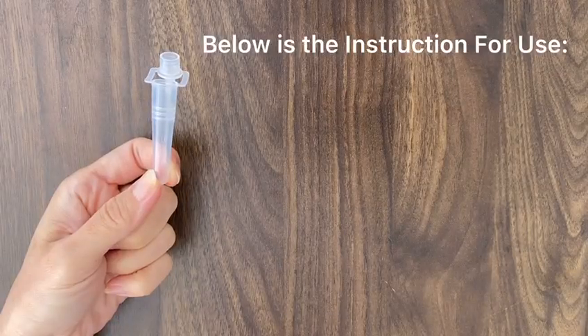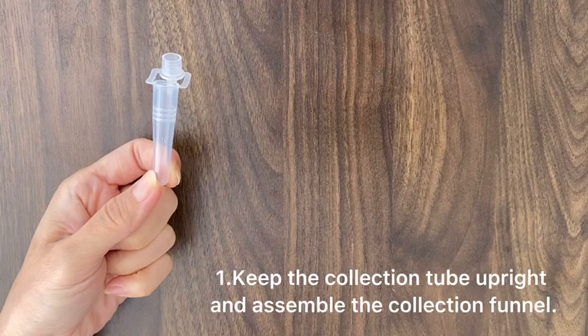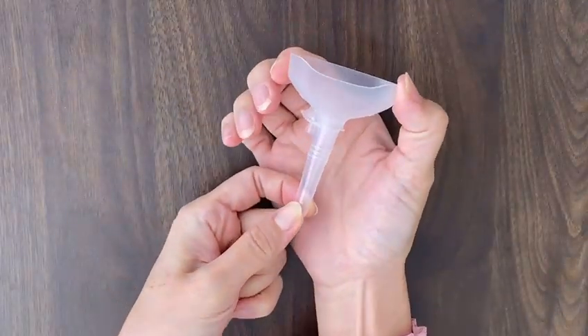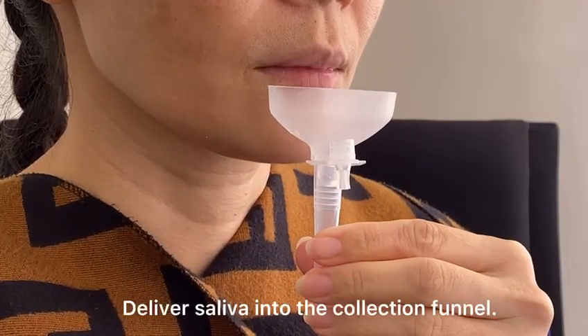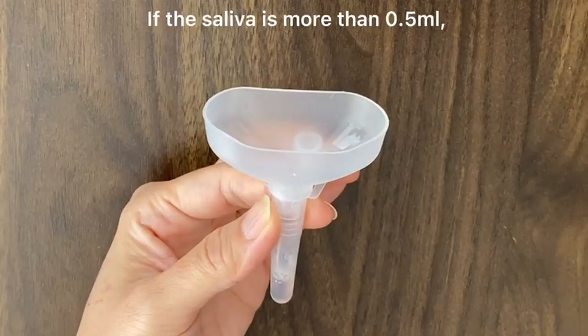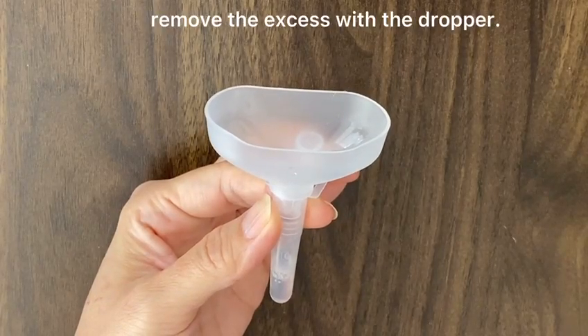Below is the instruction for use. First, keep the collection tube upright and assemble the collection funnel. Next, deliver saliva into the collection funnel. If the saliva is more than 0.5 ml, remove the excess with the dropper.